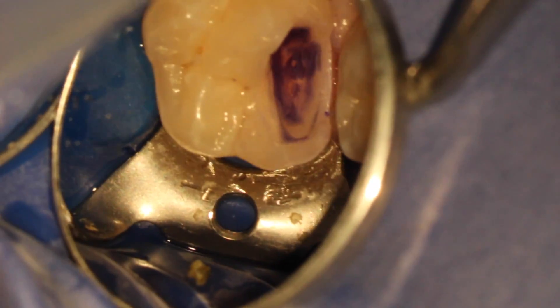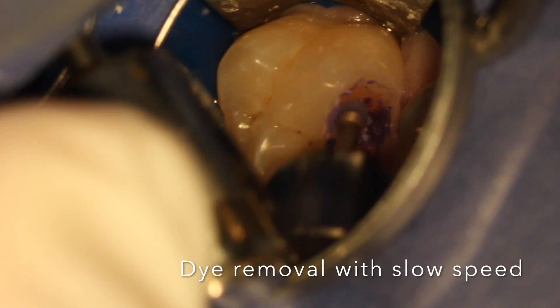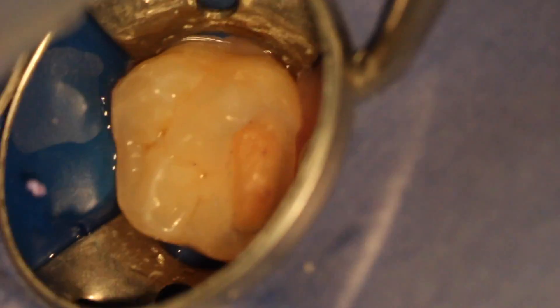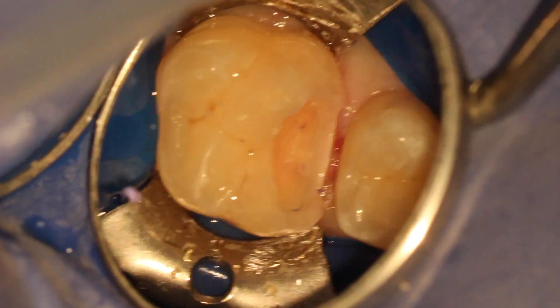So here, rinse was done, and you can see the blue dye was picked up by the softer dentin, and slow speed to clean it out. Rinsed again — there's still some present, so we repeated the steps of caries indicator, rinse, and slow speed caries removal.